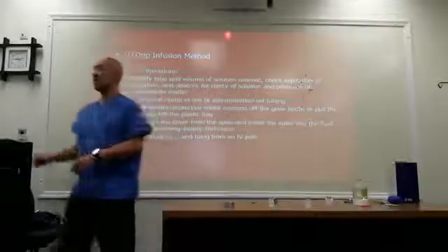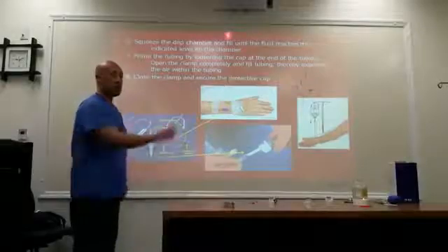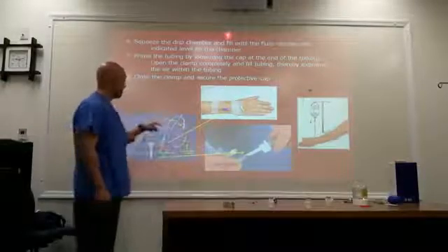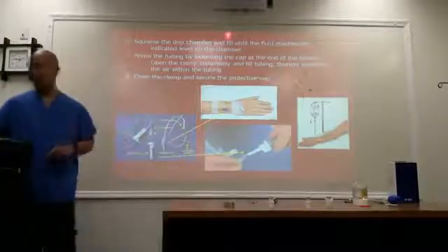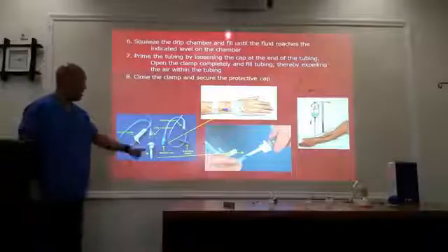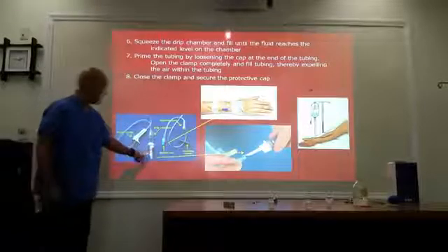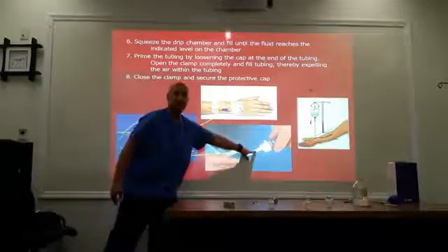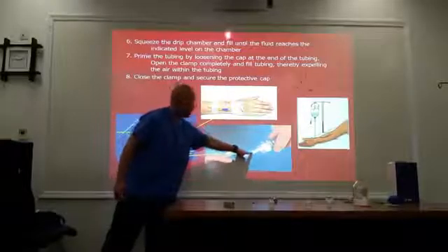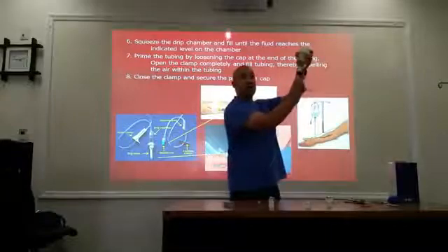You're going to have yourself an IV line that looks like this. I don't have one with me. I mean, I have one there, but I don't have one to actually show you because it's already connected. But you have an IV line. You have a plastic tip at this end, and this is what you connect into your contrast.